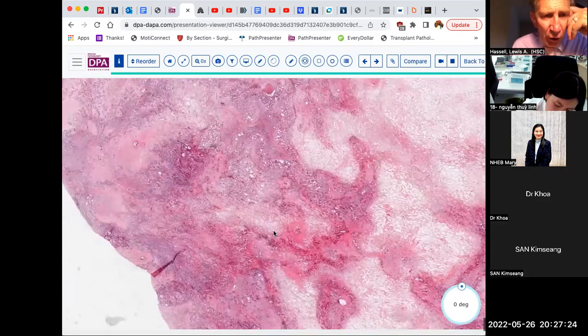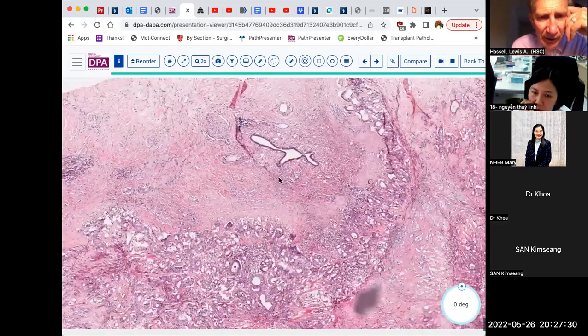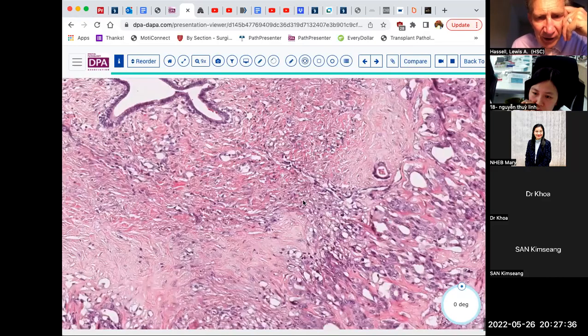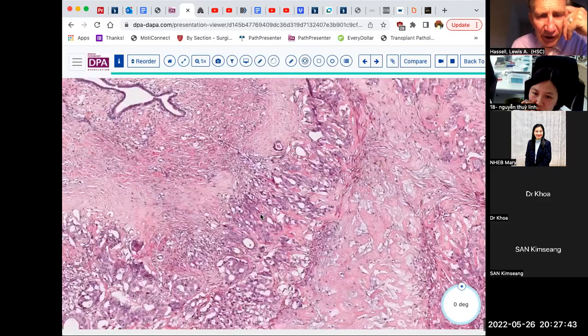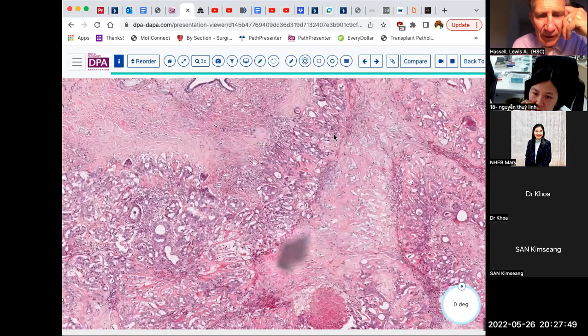We don't have any normal liver tissue on here for comparison. Well, maybe this is a normal duct up here. So yeah, this is probably a normal bile duct here. And in comparison, here's our neoplastic glands here. Higher grade nuclei, a little higher grade carcinoma, more spindly shaped a little bit as well.